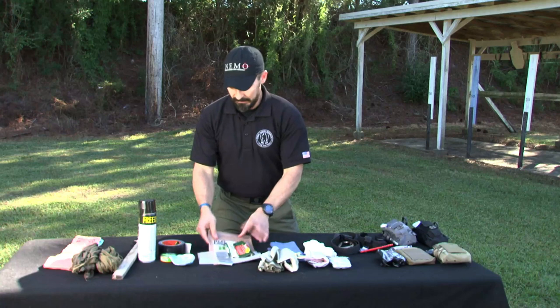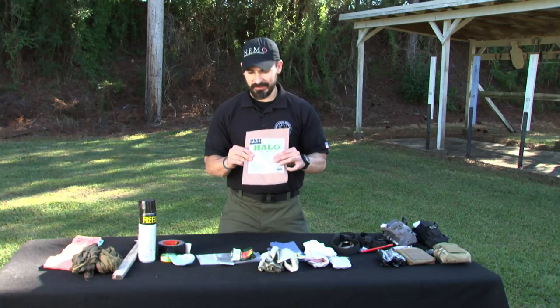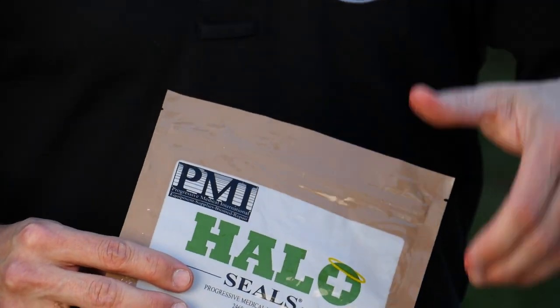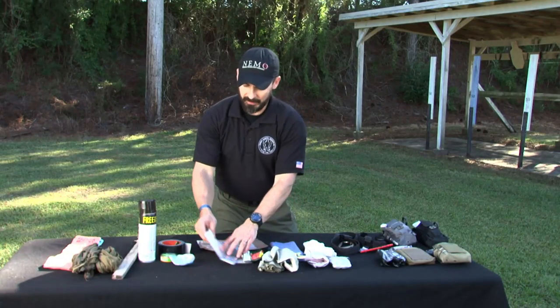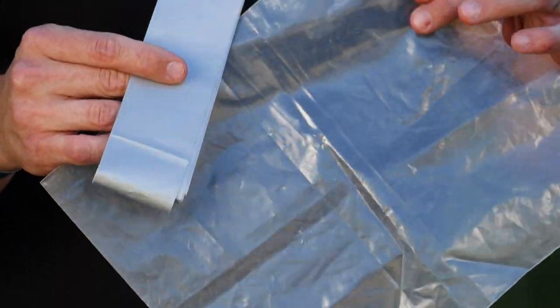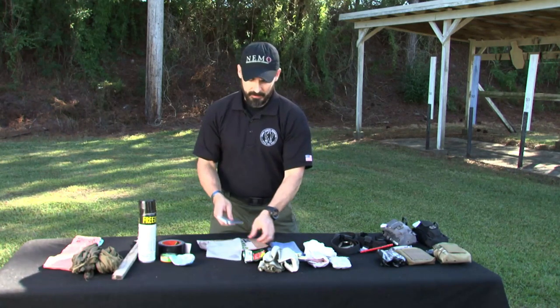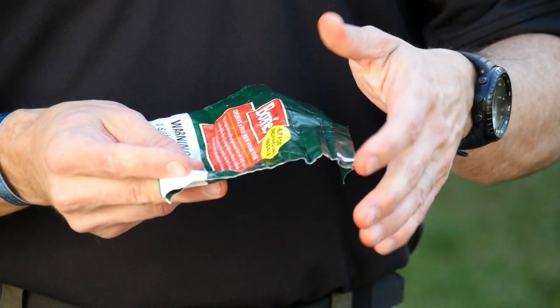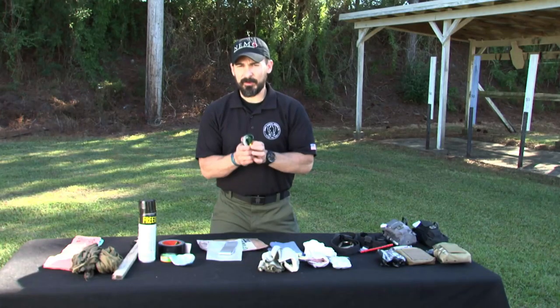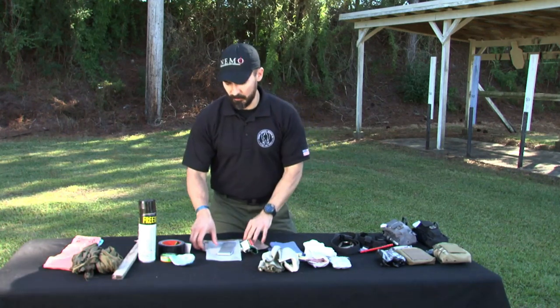How about a chest dressing? If somebody has penetrating thoracic trauma, they may need an occlusive dressing like this Halo Seal. If you don't have a chest seal available, use something non-porous from your environment — plastic bags and good old-fashioned duct tape work very well. It doesn't have to be fancy, it just has to work. You could even use a chewing tobacco bag, which is non-porous. As long as the edges are covered and you leave a small area for a vent, you'll keep that thoracic cavity covered with an occlusive dressing.